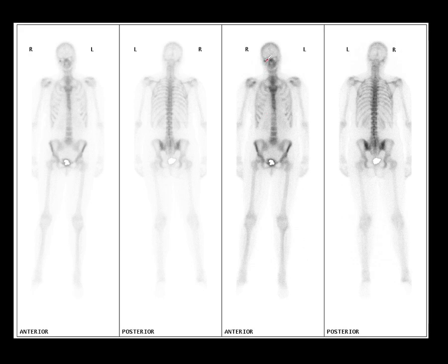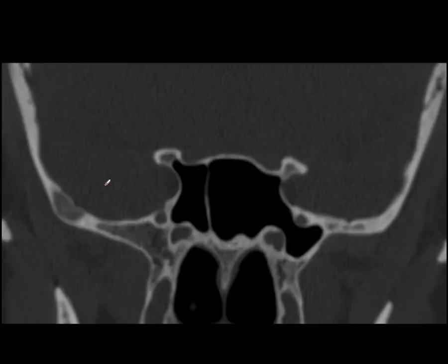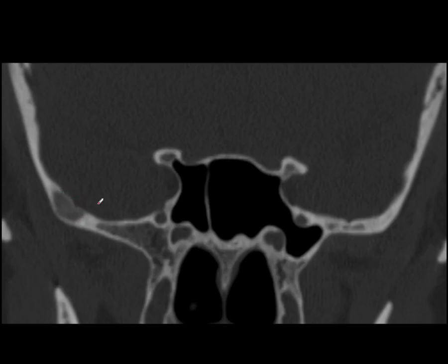We proceeded to do a CT scan, as we didn't have a SPECT-CT machine at the time. It showed the classic ground-glass appearance with very marked thinning of the cortex, but not destruction. This is an area of fibrous dysplasia in the temporal bone.